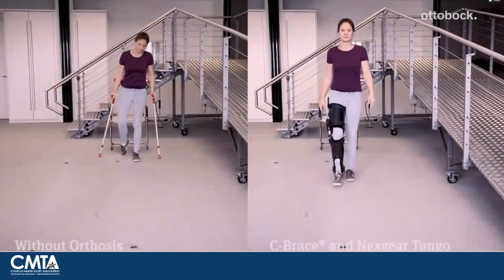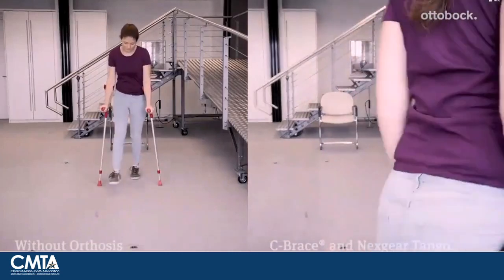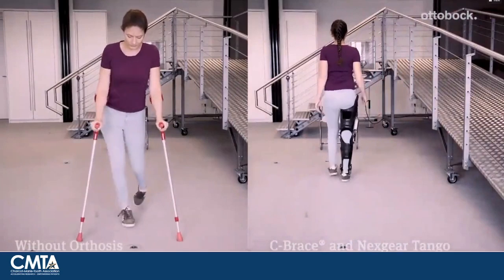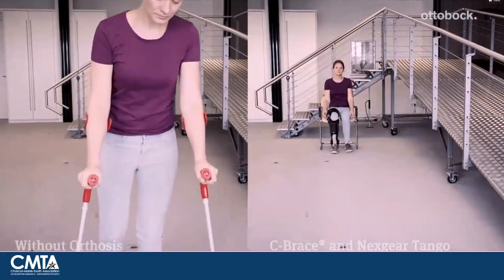And same thing, right? She's looking down at the ground immediately in front of her rather than looking out at where she's trying to go, right? So when she's got that C-brace on, you can see a lot more confidence in her ability to get from one point to the next.